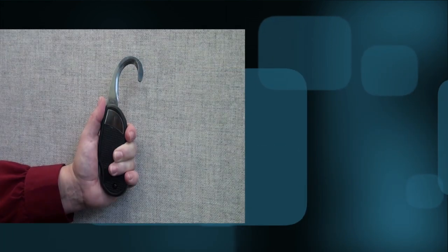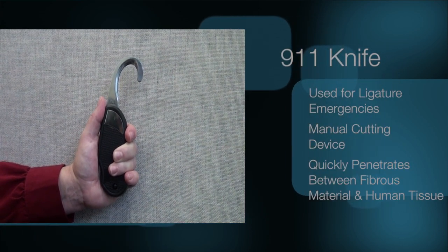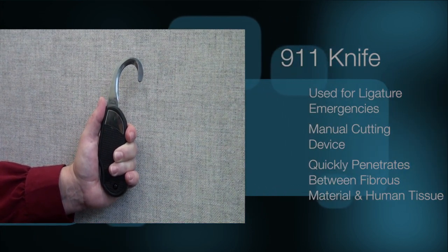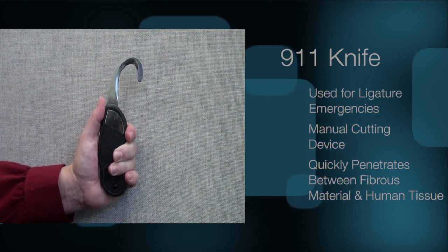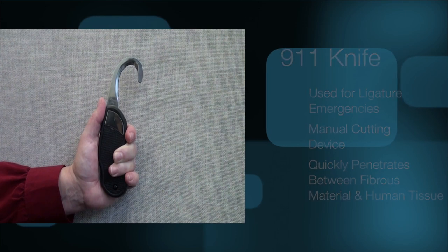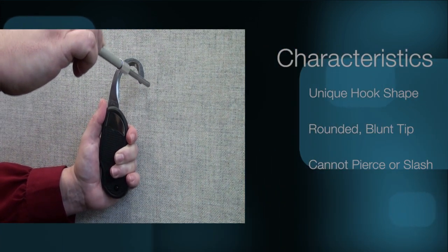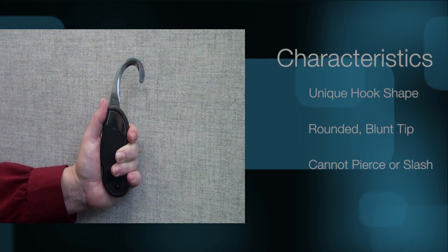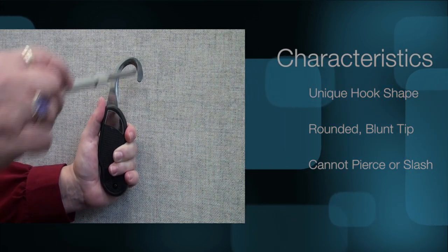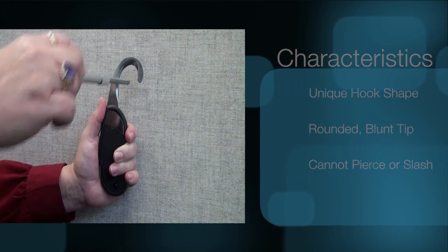The 9-1-1 knife is used for ligature emergencies. It is a manual cutting device that quickly penetrates between fibrous material and human tissue and rapidly cuts the material to reduce victim injury. Because of its unique hook shape with rounded blunt tip, it cannot pierce or slash. The outer edge of the 9-1-1 knife is dull and the sharp cutting edge is on the inside of the blade.